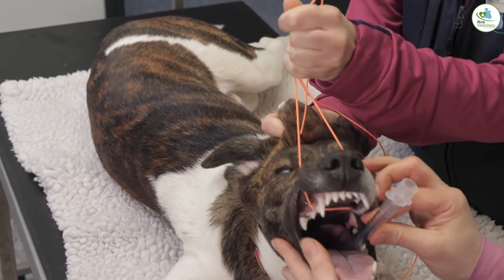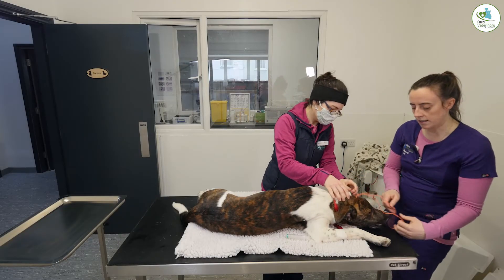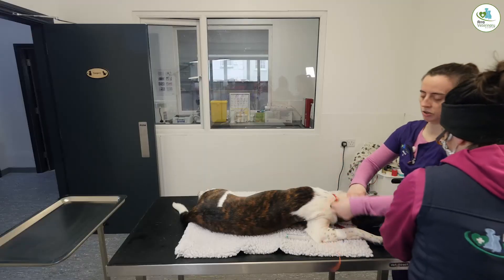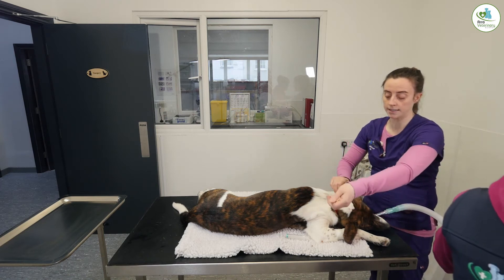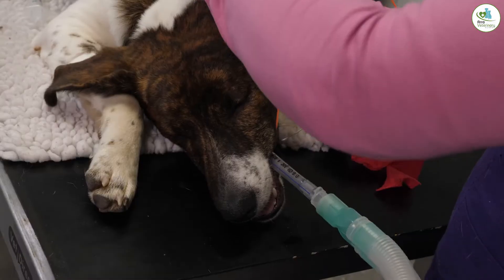We have that placed, so this will make it safe — we can give him oxygen and his anesthetic to keep him comfortable. We're just tying it in place now, and Anya is going to connect him and attach him to the oxygen and our gas anesthetic.